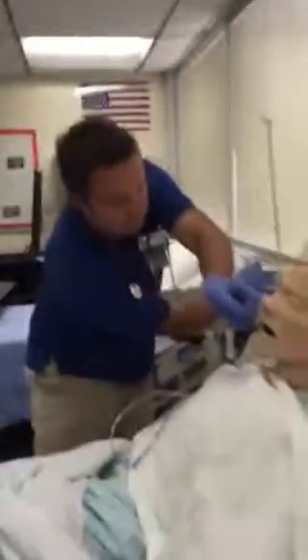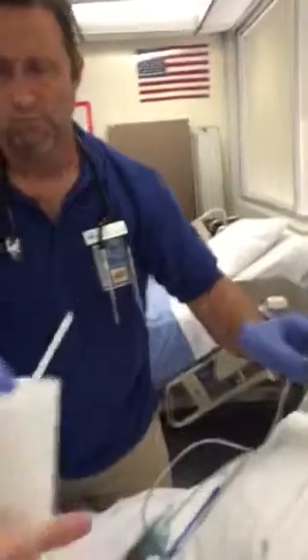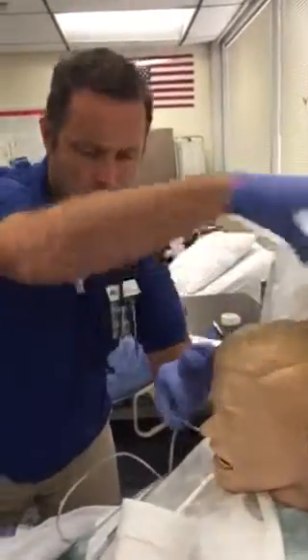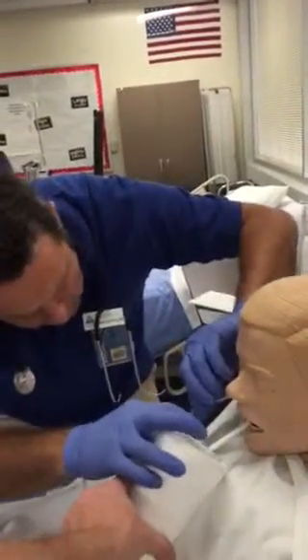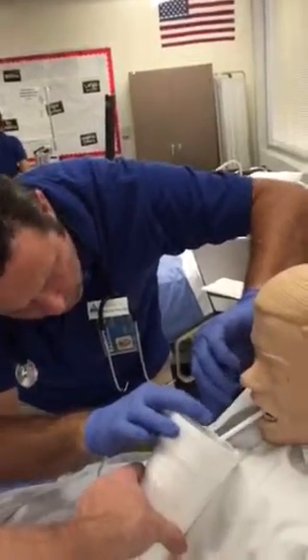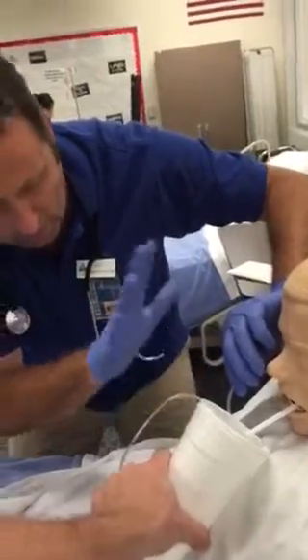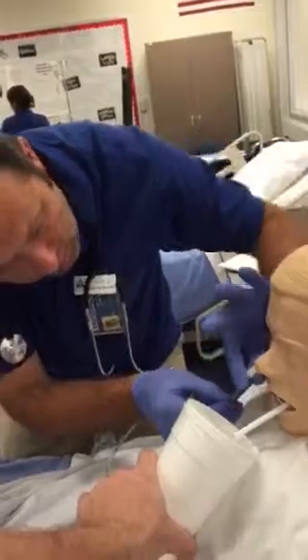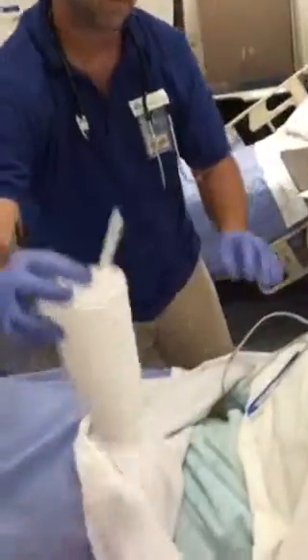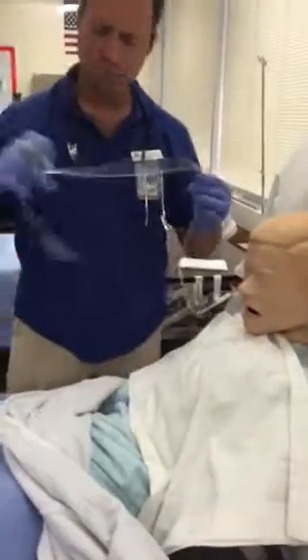Okay, I'll tell you what, now as we continue, I want you to hold. My magic hand is going to hold that as we tilt his head forward. Chin to chest, there you go. Now my magic hand is going to give him a little sip of water. Now swallow, and as he swallows, we're going to advance the tubing in. If he has cough and choking, if he has any issues, we can withdraw a bit and let him rest a little bit, but he's taking it okay. So we're going to advance until our tape hits. Boom. So we've hit our limit. All right, we're going to take our 60 milliliter syringe.